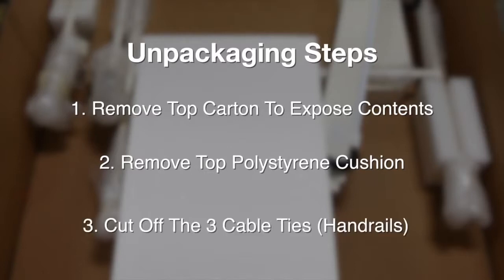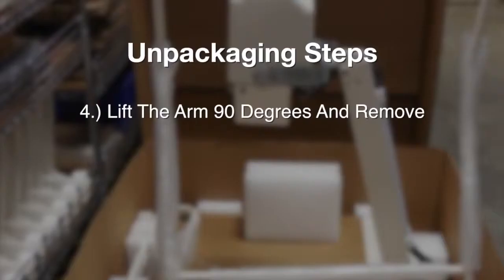Next, cut off the three cable ties on the patient handrails. Carefully lift the arm of the podiatry support base up to 90 degrees, remove, and then gently set aside. Keep in mind the podiatry support base contains a spring-loaded arm with 500 pounds of force. Never remove the x-ray head while the arm is in a position other than the 90 degrees vertical.